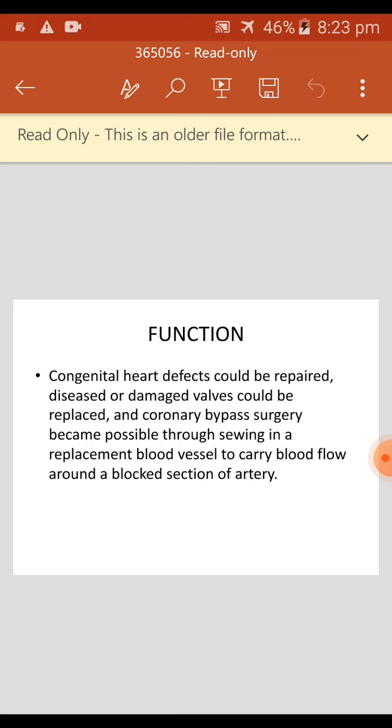Next filter is depth filters. Made of Dacron wool or polyurethane foam, they are inserted into cardiotomy reservoirs and are used mainly for partial filtration. The pore size can vary from 80 to 100 micrometers for coarse separation of particles.